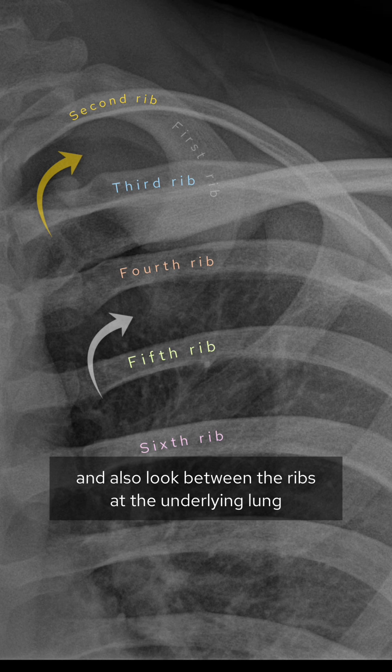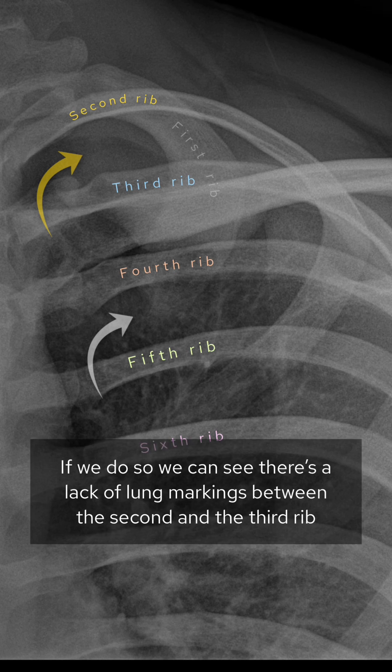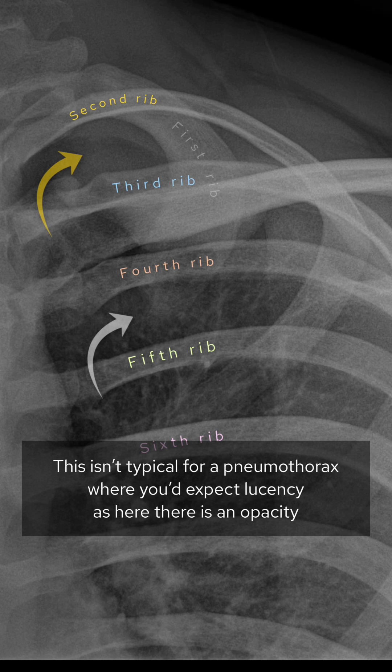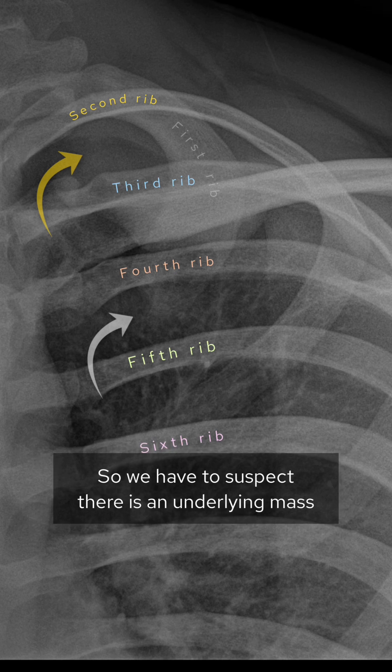Also look between the ribs at the underlying lung. If we do so, we can see there's a lack of lung markings between the second and third rib, unlike the rest of the lung. This isn't typical for a pneumothorax where you'd expect lucency — here there's an opacity, so we have to suspect an underlying mass.